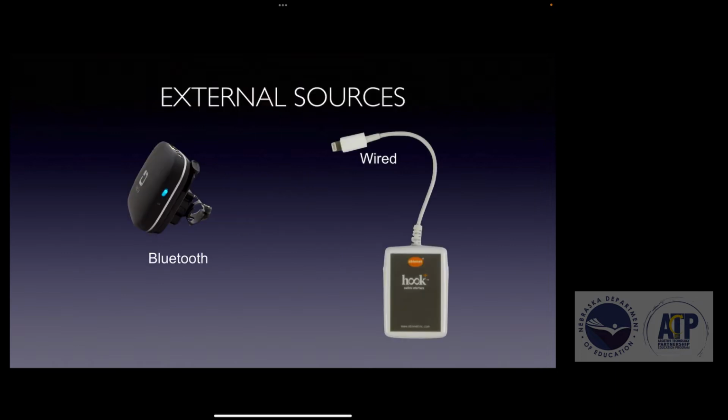So when we talk about external solutions, there are external sources available. You have Bluetooth as well as wired switch interfaces that will allow you to access the iPad. And we'll talk about the benefits and the downfalls of each one.